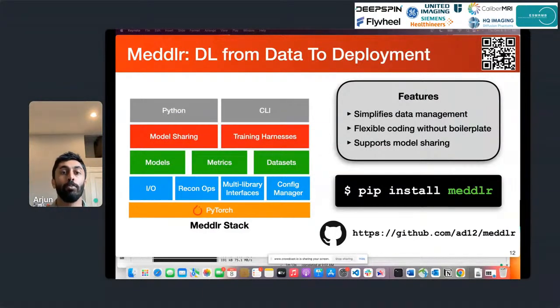So you can go ahead and train your models, have your experiment files, things like that, but it's very easy to go ahead and share the models and build the links and host them in pretty strict and shareable ways. So like standard Python libraries, it's pip installable, so you can install it in any virtual environment or directly onto your system.